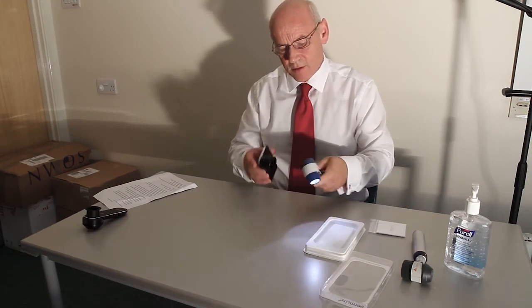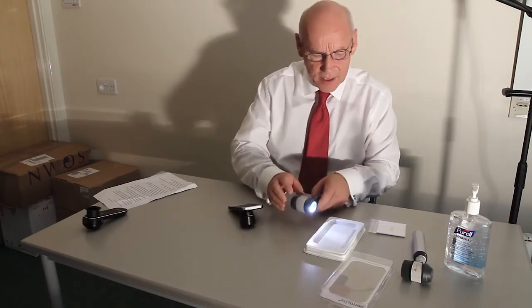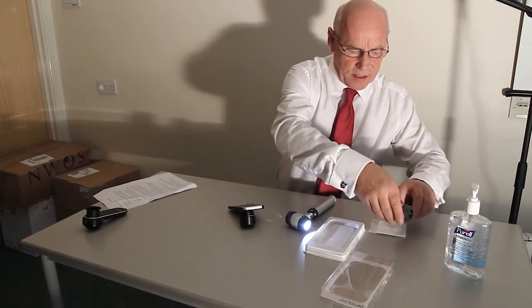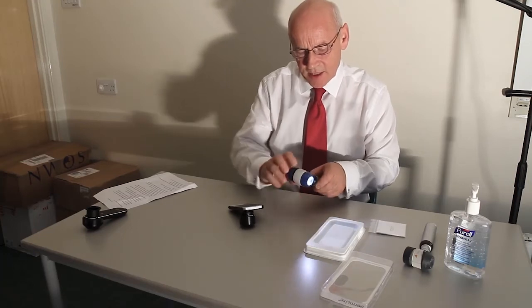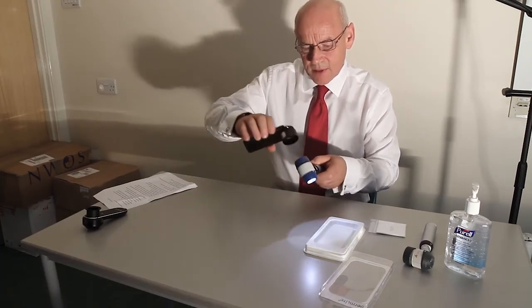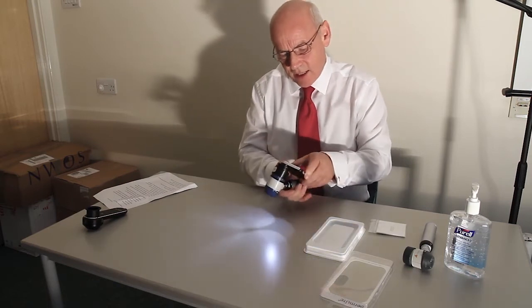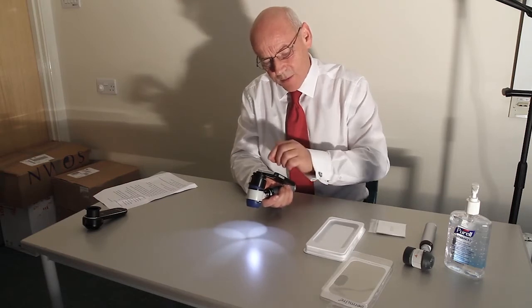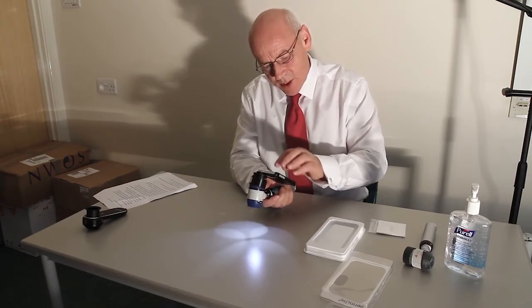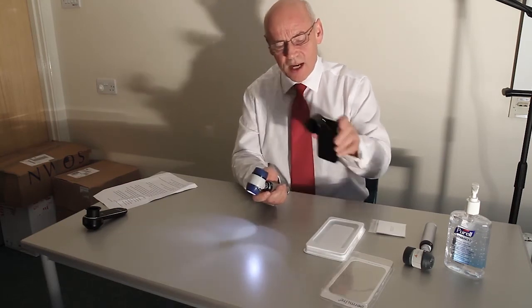Turn the dermatoscope on. That fixes onto here. You need to have the ring in here. So again, you would have had a split ring which slides over that. That tightens down like that. That goes on there like that. Swing it round, and then in exactly the same way, you open the image out. When you're happy you've got the image you want, you can tap on it if you wanted to get better focus, and then you just take the photograph. And you now have that photograph on your phone.